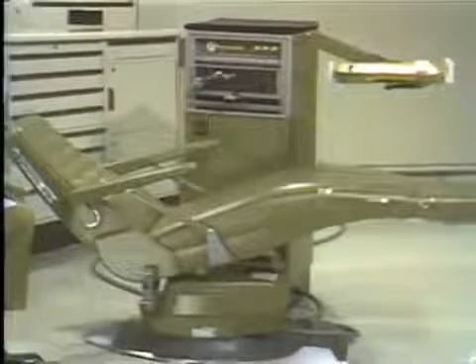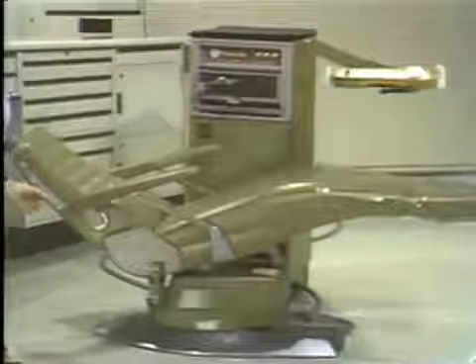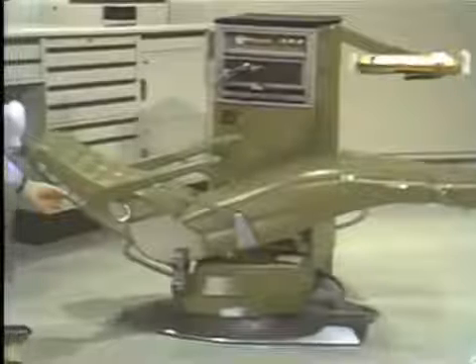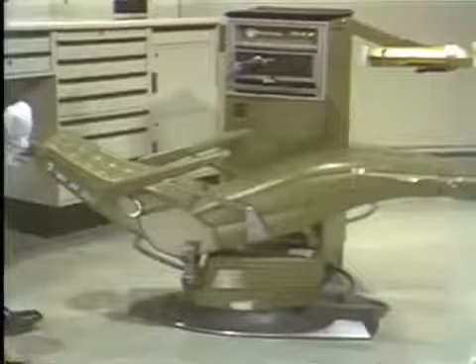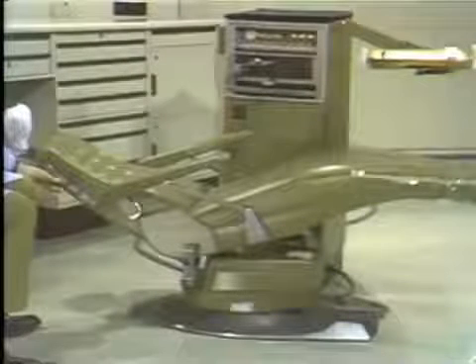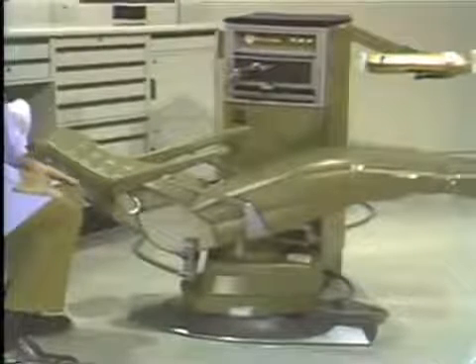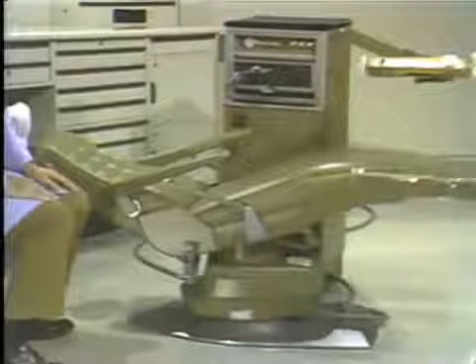For the lower left quadrant, the chair is in almost identical position, except that the back is dropped to about the plus 25 mark. About there. You may find it necessary to raise the chair slightly. And when we have the patient in position, I'll show you the relationship between the patient and the operator.